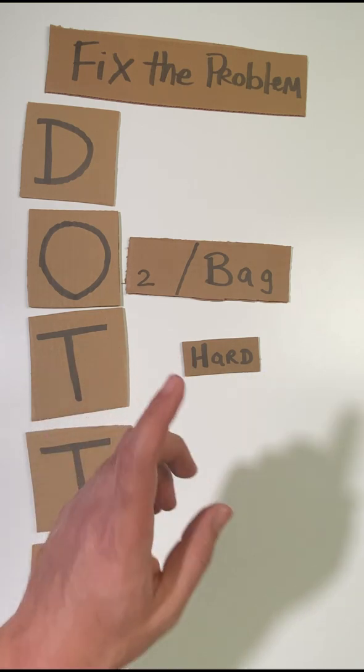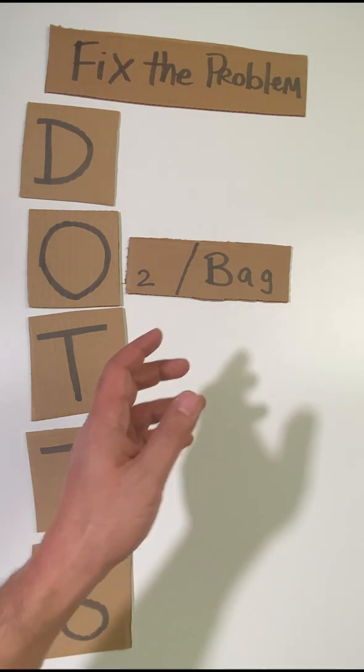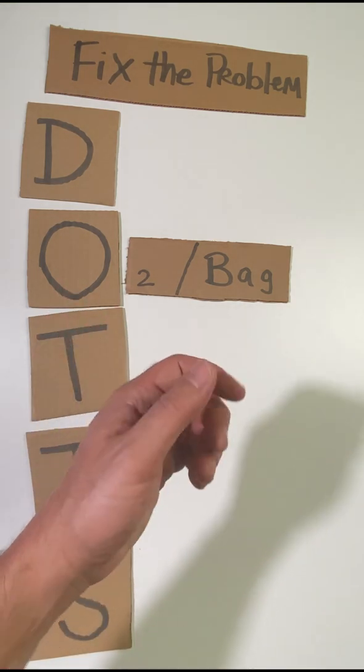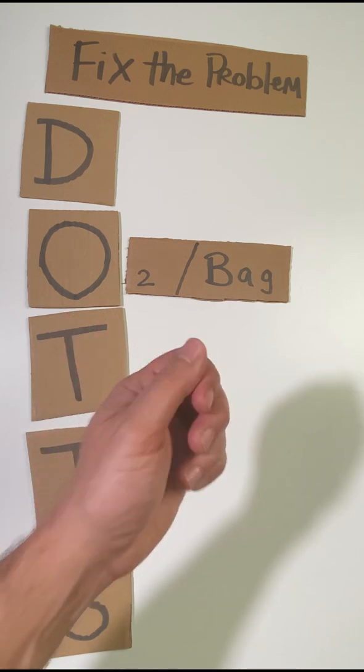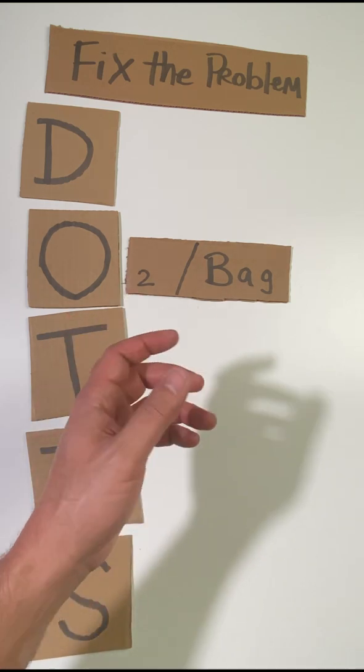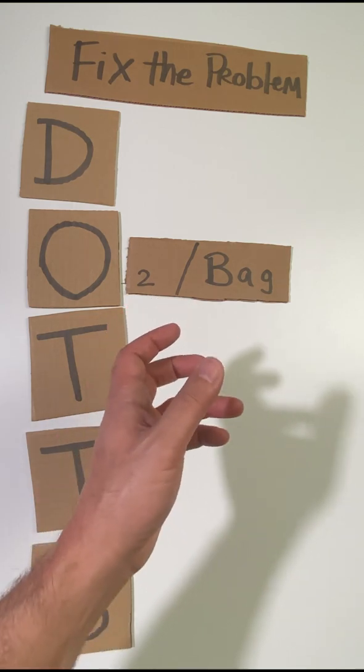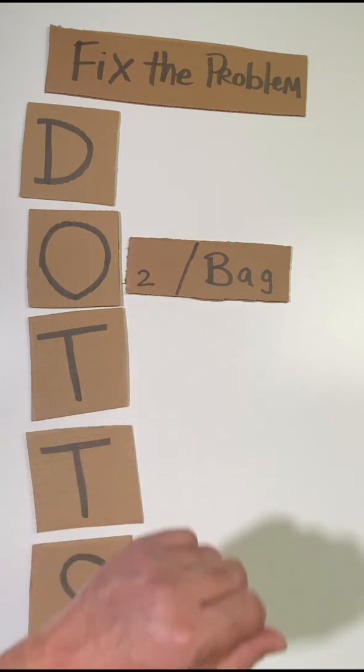One more thing that you might want to do is as you're bagging them, go ahead and feel that pilot balloon just to make sure that it's fully inflated. If it's deflated, then you think about a leak in the system, and maybe that endotracheal tube has a leak in it and that's why it's not creating a tight seal in the trachea.